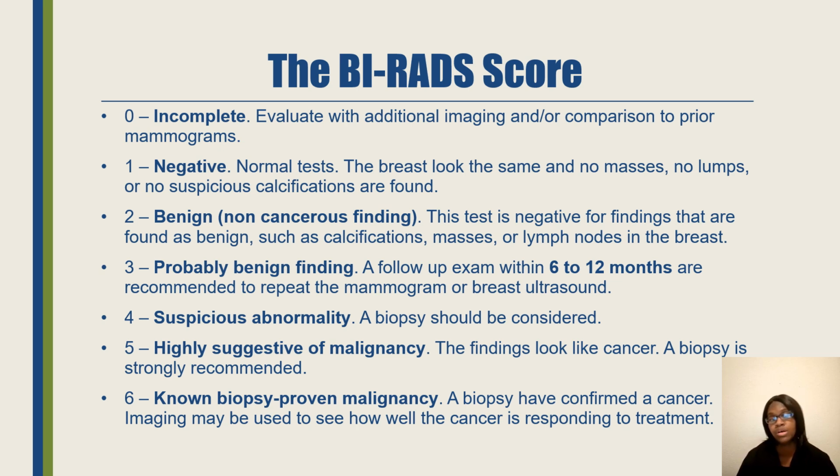If it's a score of 4, that's a suspicious abnormality. A patient should come back in for a biopsy. Number 5, highly suggestive of malignancy. Whatever was found in the breast looks like cancer, so the radiologist will strongly recommend a biopsy. Number 6, if it is a proven biopsy for malignancy and a cancer was confirmed, that would be for number 6.